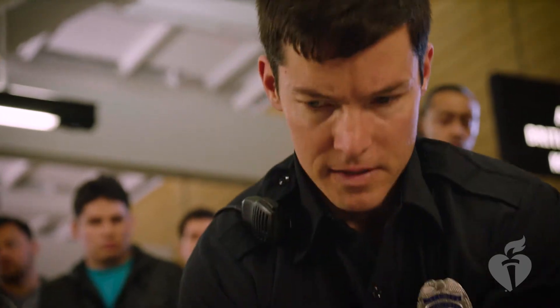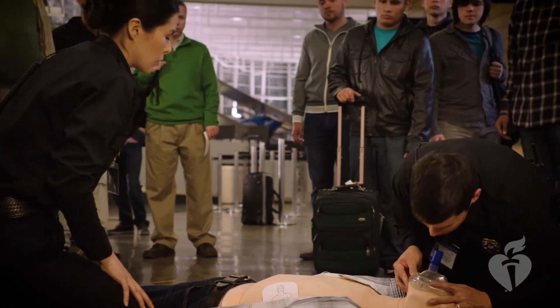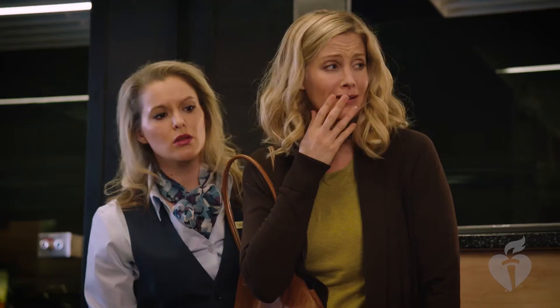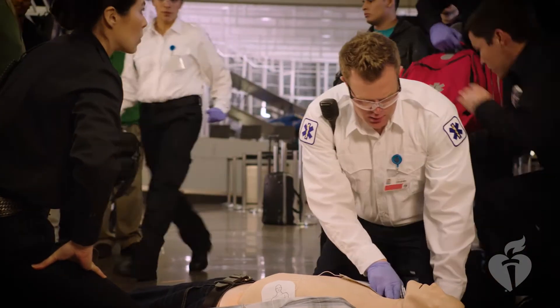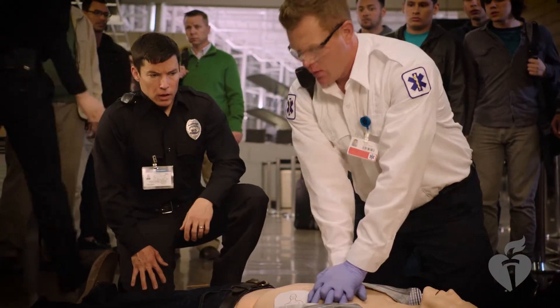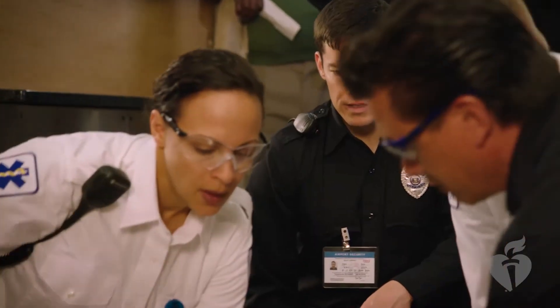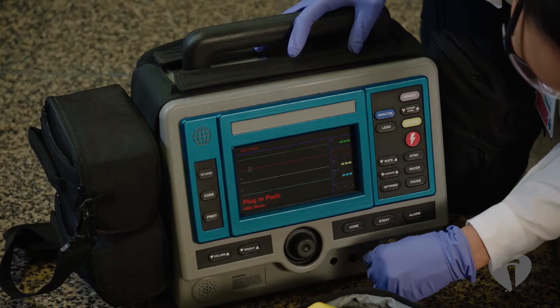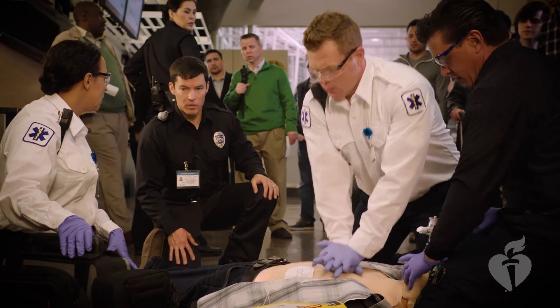Shock delivered. Are you okay to continue? Let me know when you need me to take over compressions. Excuse me, I'll take over compressions. Checking a pulse — he's got no pulse, he's not breathing. Starting CPR. How long was he down? About two minutes. I started CPR right away. She attached an AED. Did you deliver a shock? We did deliver one, and then more compressions and two breaths.